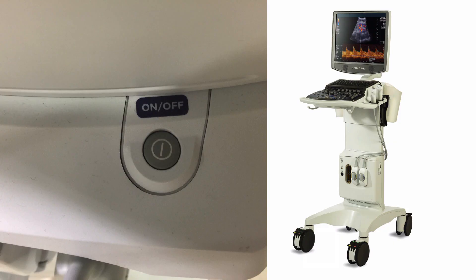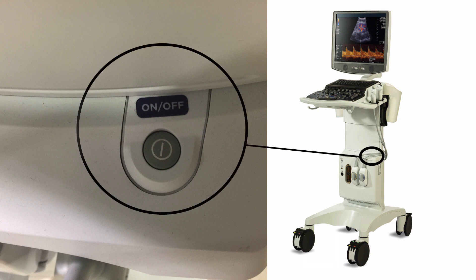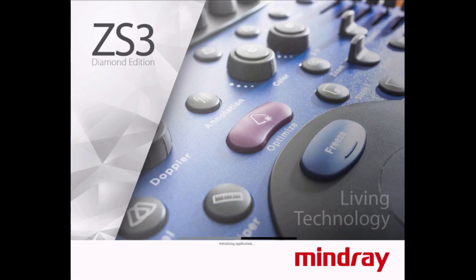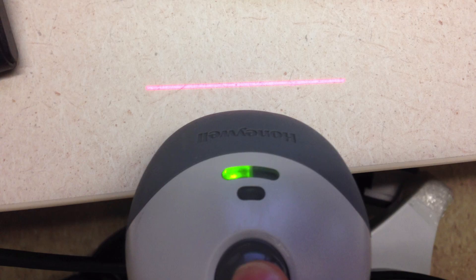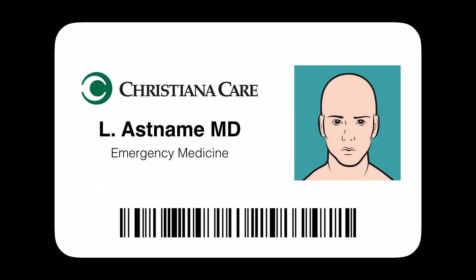Turning on the system: the power button is located on the tower near the probe connector. When first turning on the system, you will see the startup screen. As the system goes through its checks, note the progress bar at the bottom. When the machine is ready to scan, you will see the LDAP login box. This is for you to log into the machine using your 801 ID and system password. The easiest way is to barcode scan your ID badge — scan the barcode on one side of your ID badge to enter your login information into the dialog box.